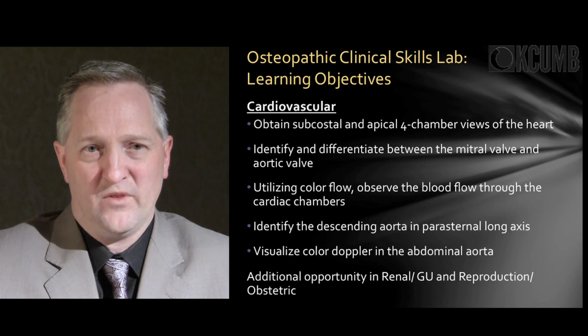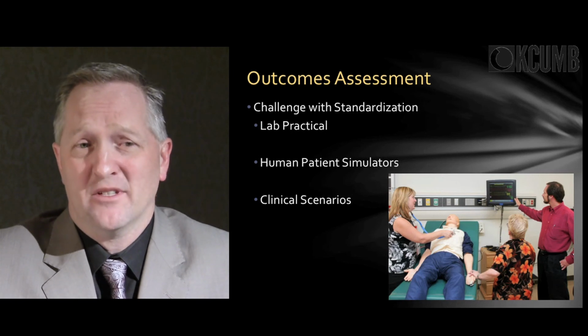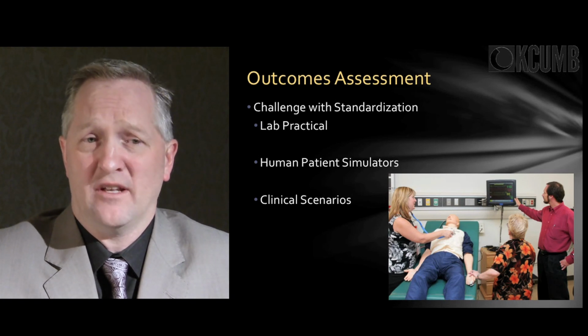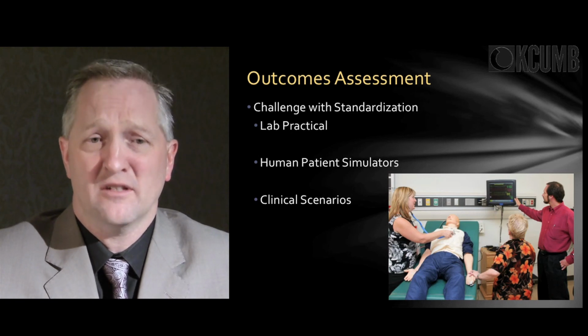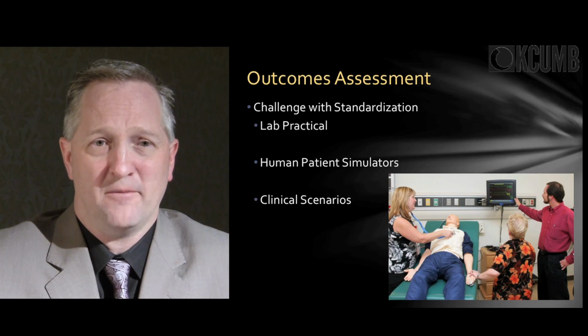And the final portion of the academic consideration is going to be your outcomes assessment. There has been some challenge with standardization. The manikins that we discussed are beginning to have some improvement on that. Opportunities lie within lab practicals, human patient simulators, and trying to integrate appropriate use of ultrasound in clinical scenarios, all of which can creatively be accomplished depending on what your perspective and priorities are.